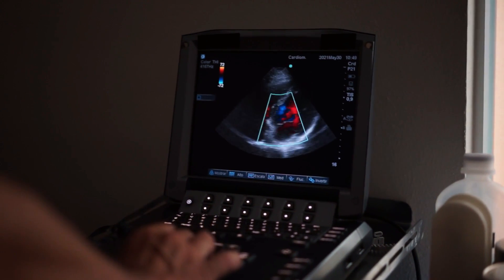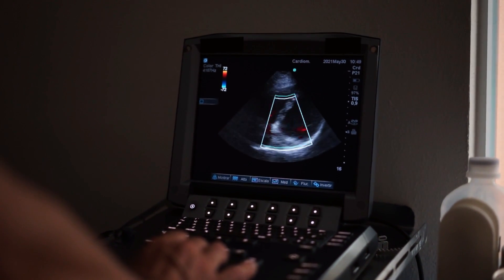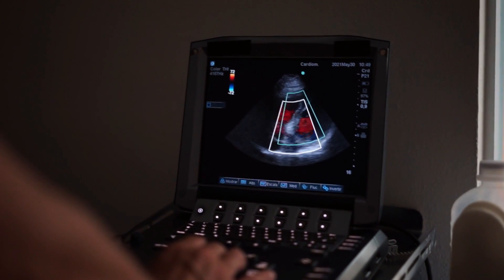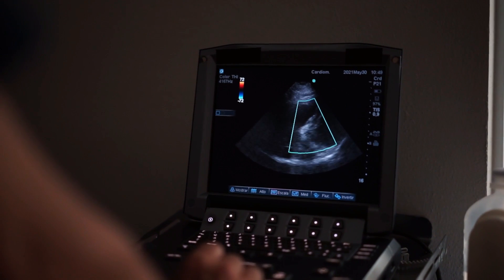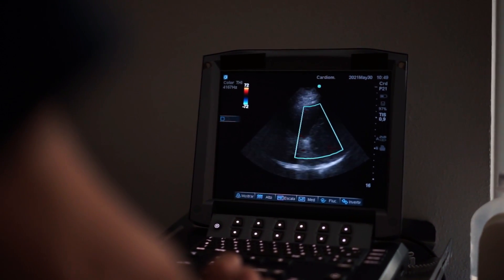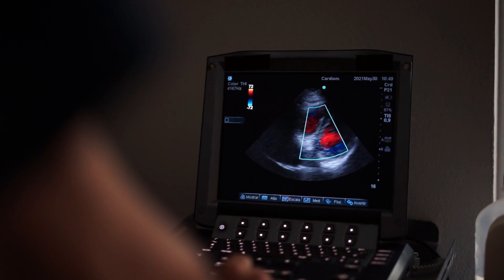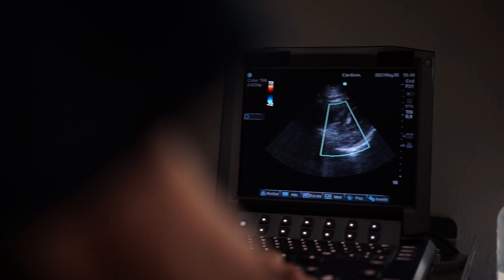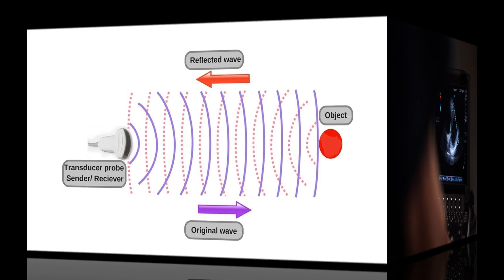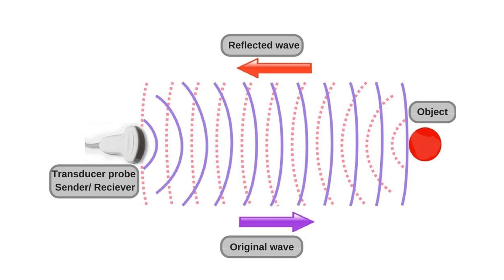An echocardiogram, or echo, is a type of ultrasound scan used to visualize the heart and associated blood vessels and to analyze the flow of blood through the heart. A small probe is used to send high-frequency sound waves that make echoes when they are deflected by different parts of the body.